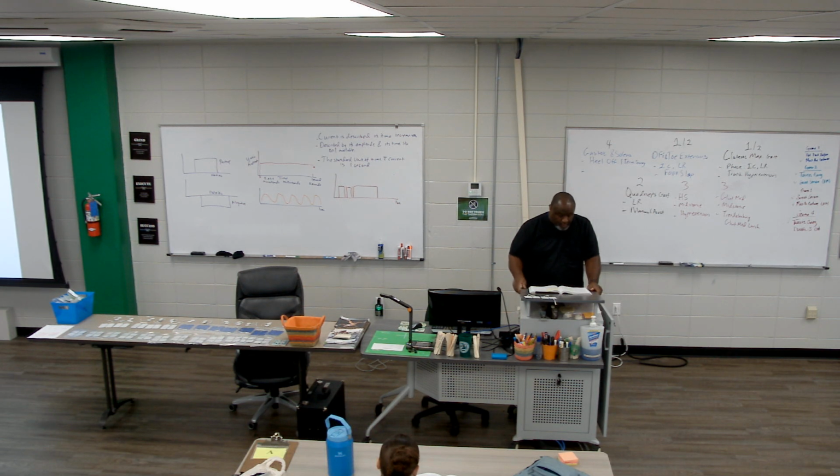So essentially, I don't want to go into that. Let's go into waveform comfort. I don't want to get you confused there, because I think you're saying it backwards. It's really pulse versus phase. Your patient is only going to feel the pulse. They're not going to be able to determine how many phases they're feeling. They're just going to know it feels like E-stim. So it's really going to be pulse over phase, not phase over pulse. So don't get confused there. So don't worry about that paragraph.